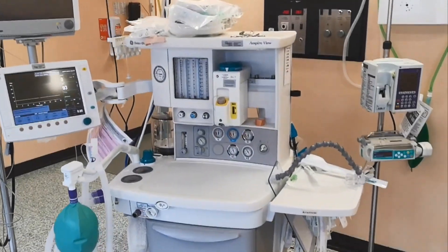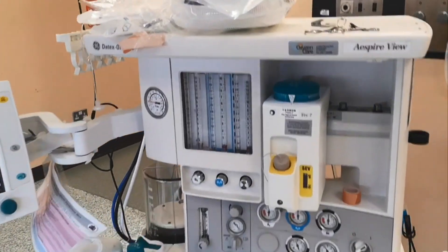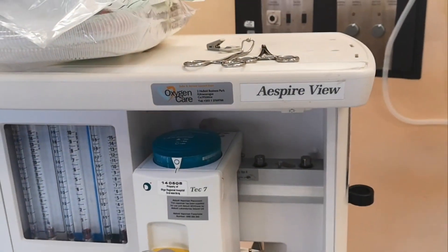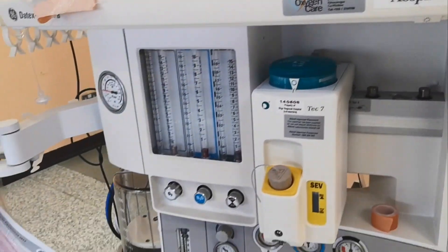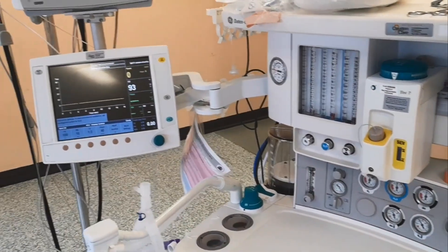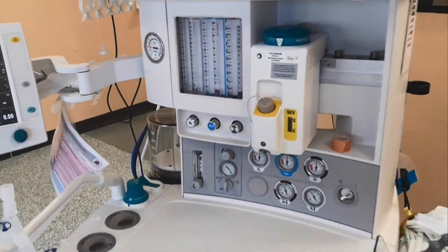This one is a Datex Ohmeda Aspire View — it's a little bit more of a vintage machine.